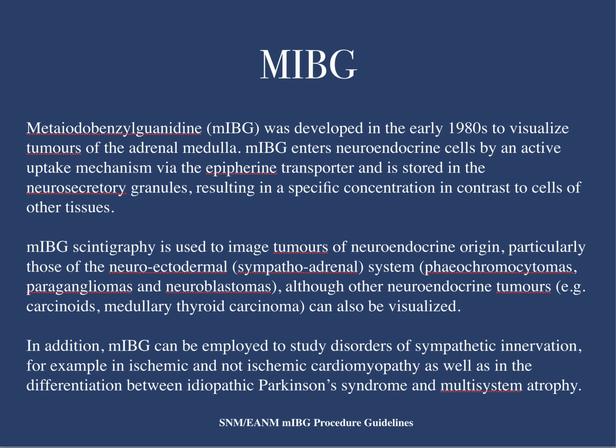Okay, now we're going to switch gears to talk about MIBG. This is something that has been around for a while. It works really, really well. It's used to image tumors of neuroendocrine origin, so particularly pheochromocytomas, paragangliomas, and neuroblastomas.